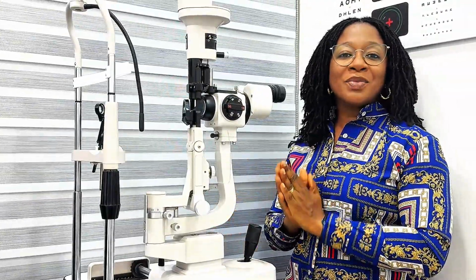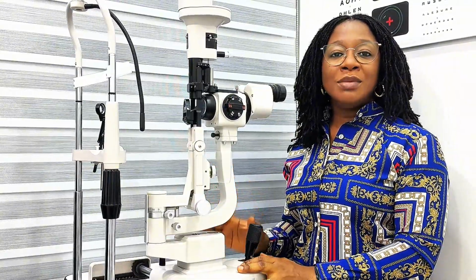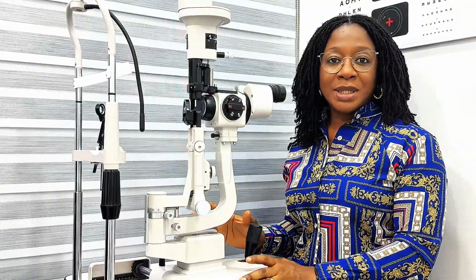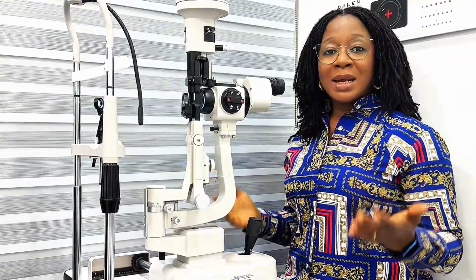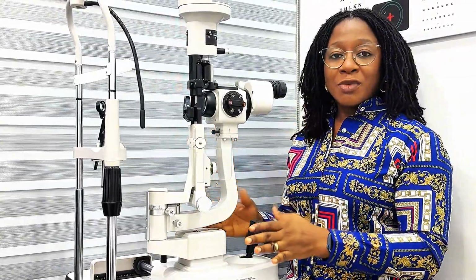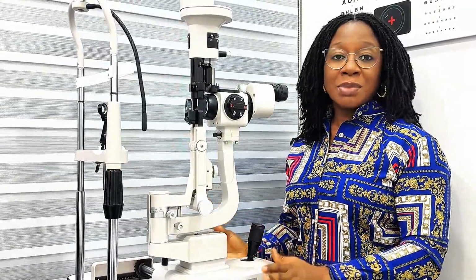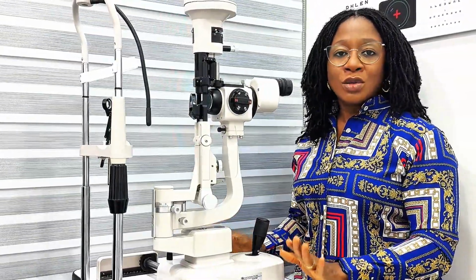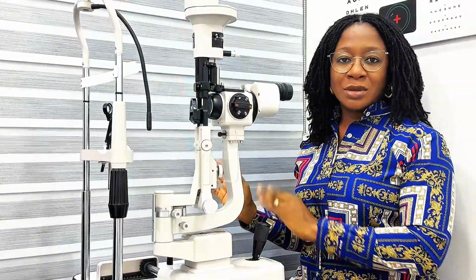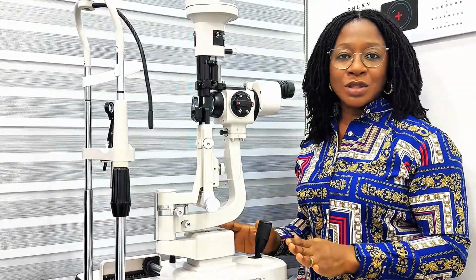But remember that when you want to perform your slit lamp examination, the illumination in your room has to be dim. We're leaving our lights on for the purpose of this video. I also mentioned in my earlier videos that for you to perform your slit lamp examination, your patient has to be prepared, your instrument has to be prepared, and you, the examiner, also have to be prepared. I have made videos on those, so you can go ahead and watch those videos and come back to continue with this.